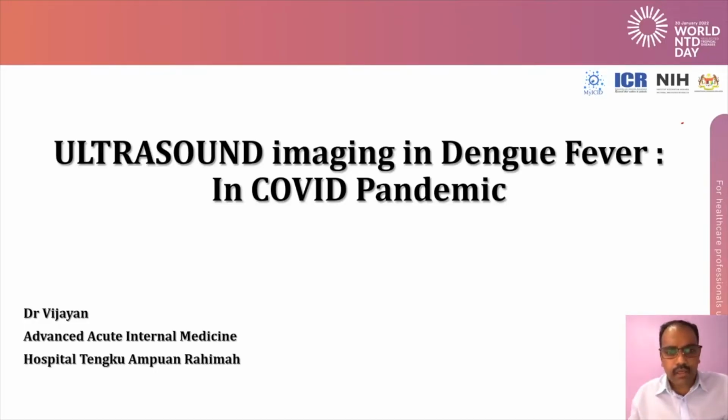Hi, good evening. Today I'll be presenting on ultrasound imaging in dengue fever in COVID pandemic. In this presentation, we'll be fully focusing on ultrasound as a method which is going to assist us in the diagnosis and treatment in dengue patients.